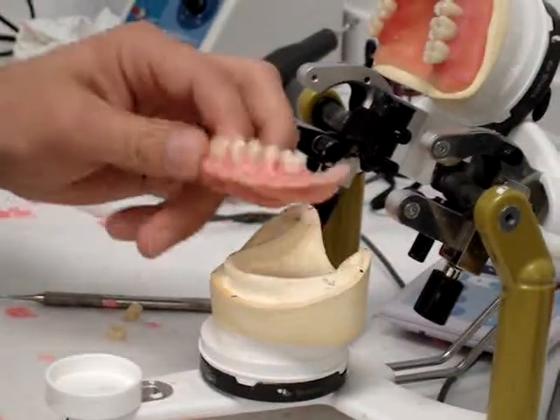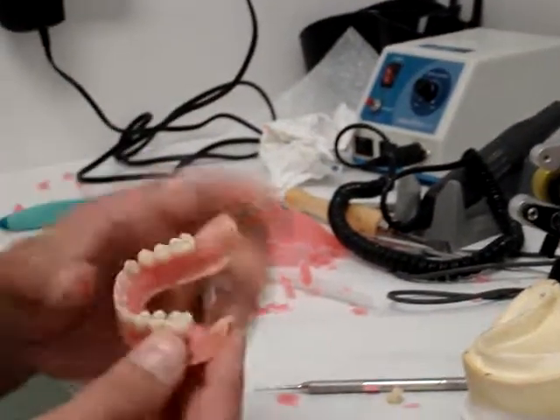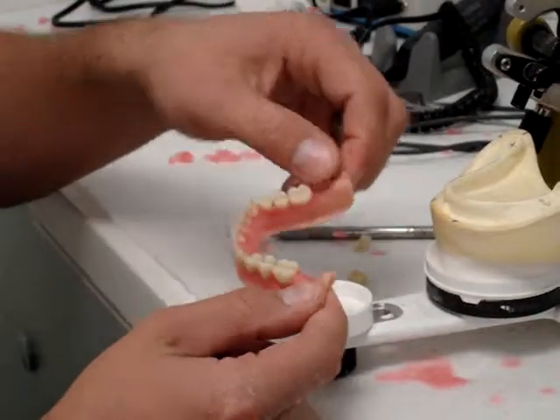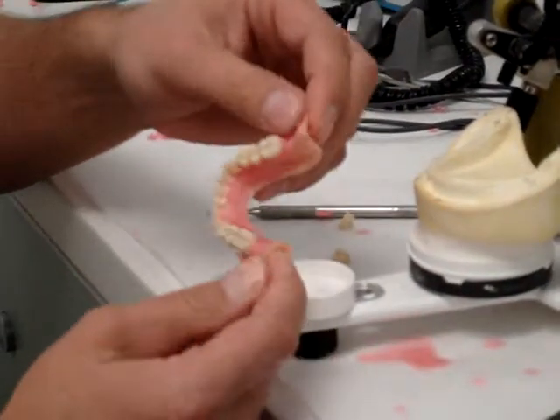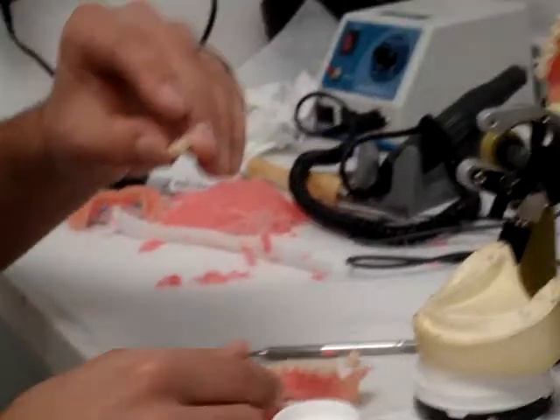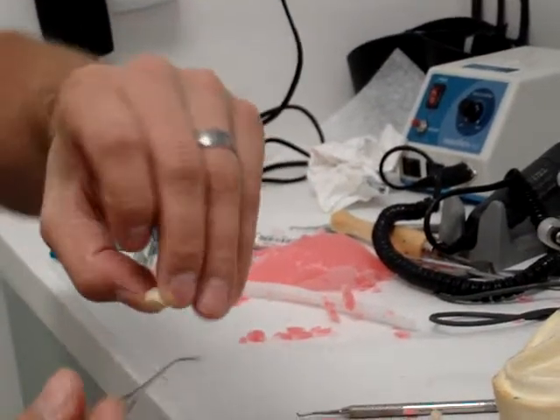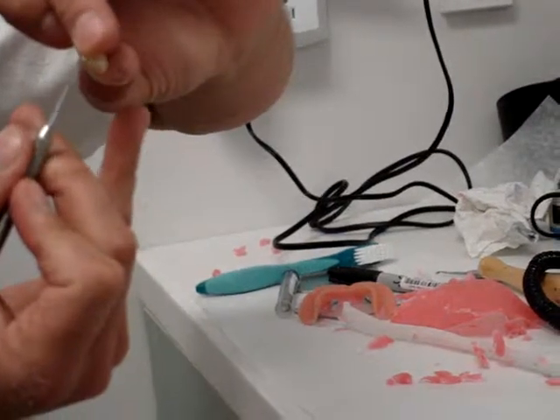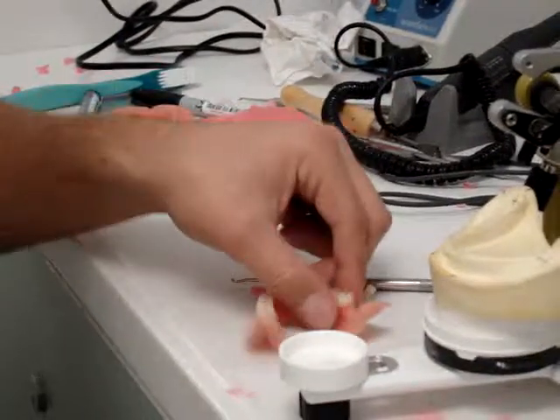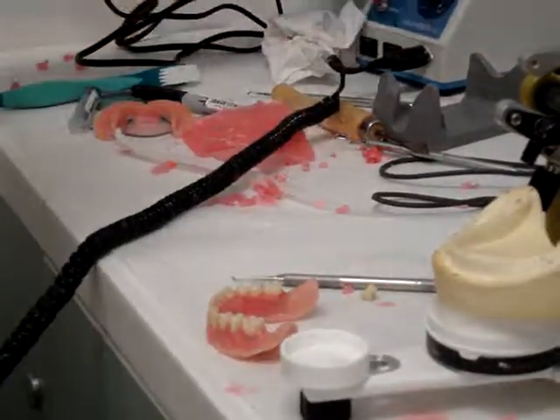First things first, because I can already tell these are going to be an issue, I'm going to go ahead and thin these retromolar pad areas out on the record base. Theoretically you should do this beforehand, but sometimes you never really know if it's going to be too thick or too thin. Thin this out first, then if you have to, you can thin out the distal edge portion, because you have to remember it's going to slope up this way, so you usually only need to take out part of the distal portion here. I'm going to smooth and thin this out, then adjust as needed on the distal portion.